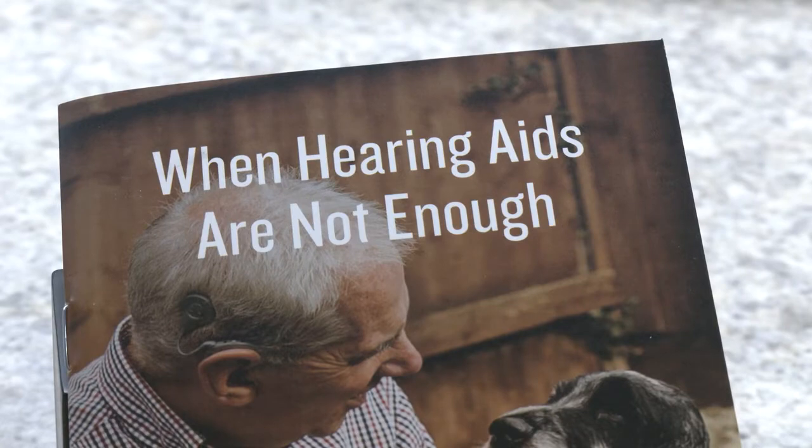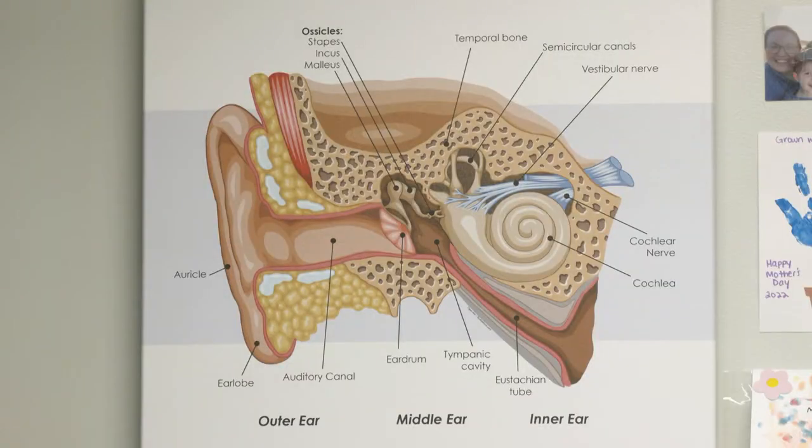Duke would end up going to Fargo and neuro-otologist Dr. Michael Shinners, who would eventually perform 2 surgeries. There's a certain type of surgery, a type of mastoidectomy, where we remove some of the bone behind your ear, where you actually need to make the opening to the ear bigger so that you can clean their ear long term when they come into the office. The negative of that is it can make it hard to wear a hearing aid because the opening's bigger and it just doesn't fit well, or the sound escapes and it just doesn't work well.